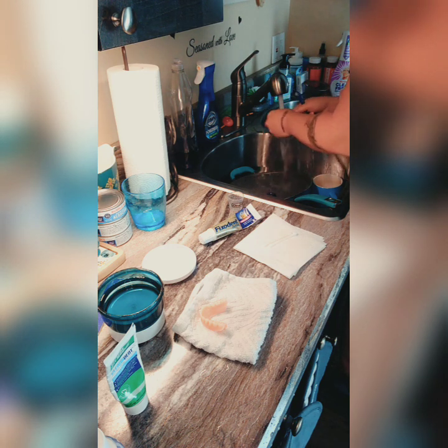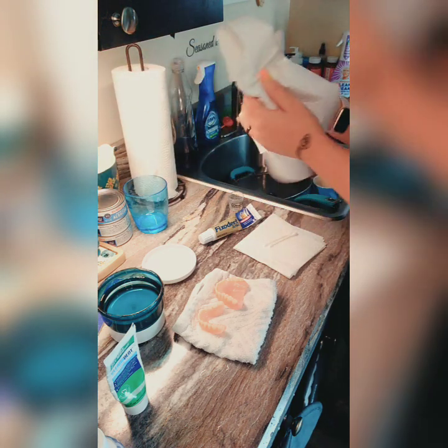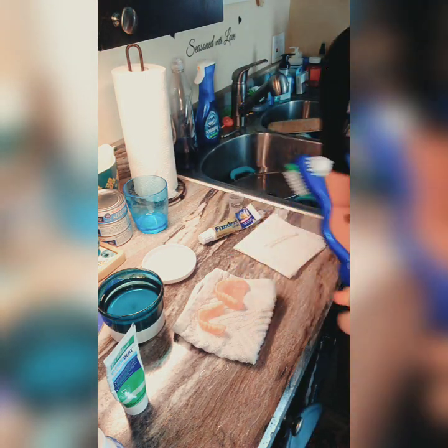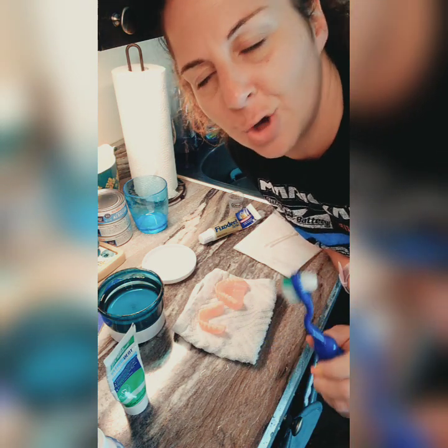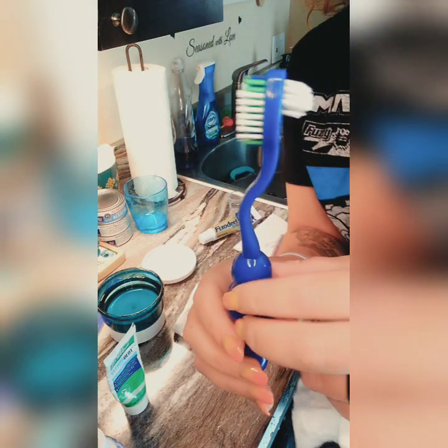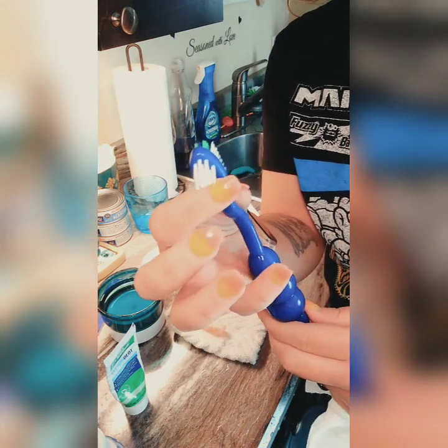Dr. B's cleaning paste and Clean It Up are the only denture products you can use in your mouth. Everything else is toxic and can harm you. Do not use any other products in your mouth — I heard somebody put Fresh and Bright in their mouth. No, no, no — that's for dentures only. This is my Dr. B brush; I have arthritis so the great grip is helpful. It has a soft denture brush side and a regular brush side.